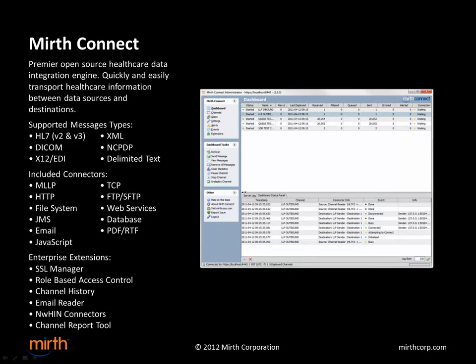And with all of these, we also support XML, because internally everything is processed in Mirth Connect as XML. So when you process HL7, it's actually transformed into XML and back. So XML is robustly supported in Mirth Connect. And using these data types, you can really pull through any type of data in Mirth Connect, even binary data, you can process through Mirth Connect.